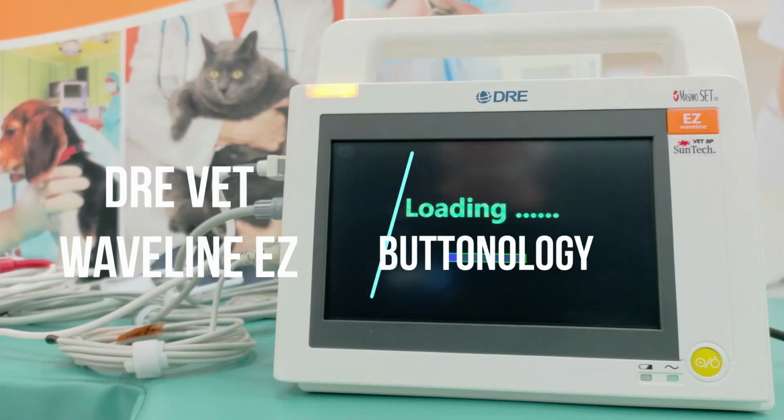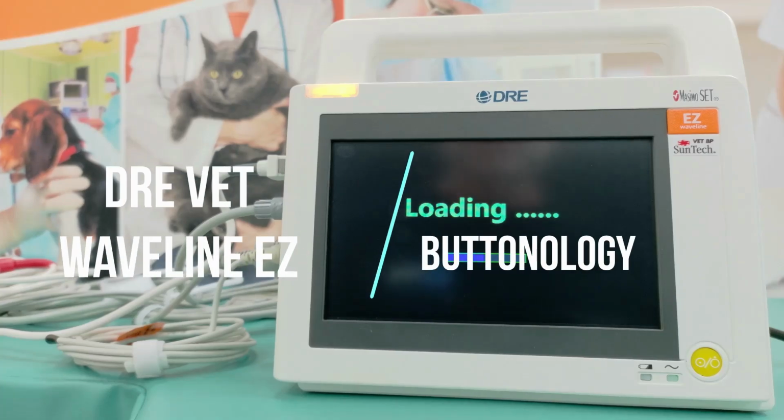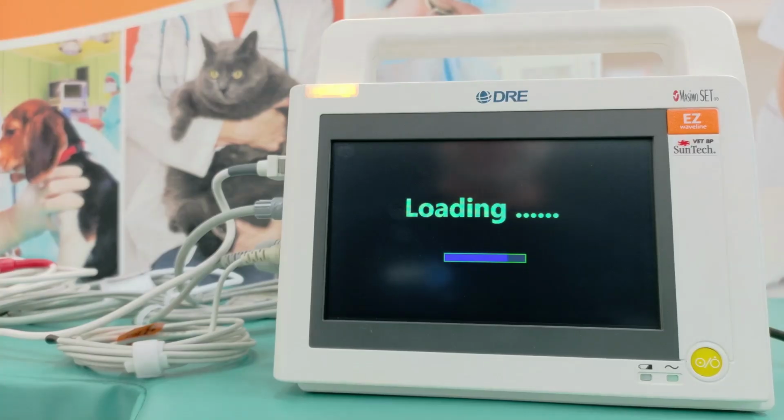The Waveline EZ. So first thing we're going to do is turn the unit on.